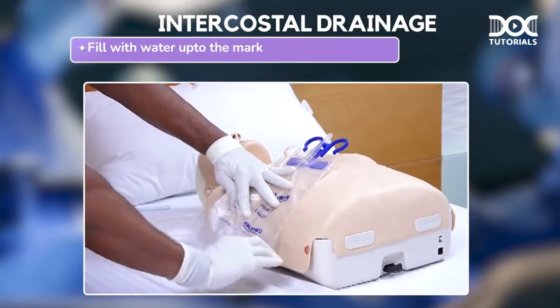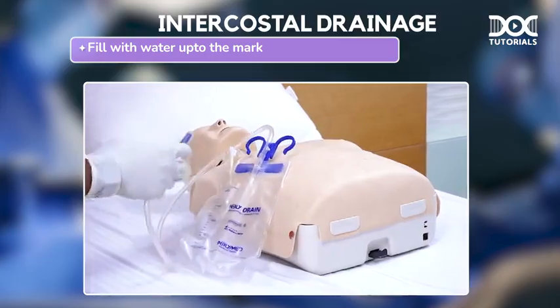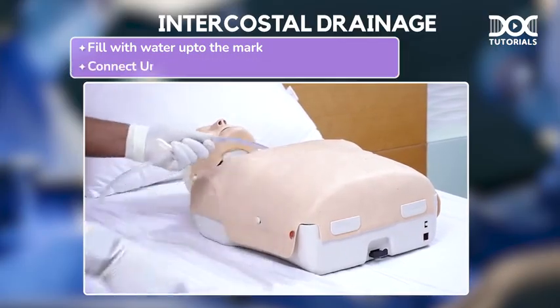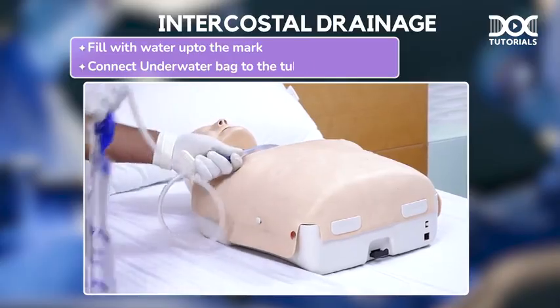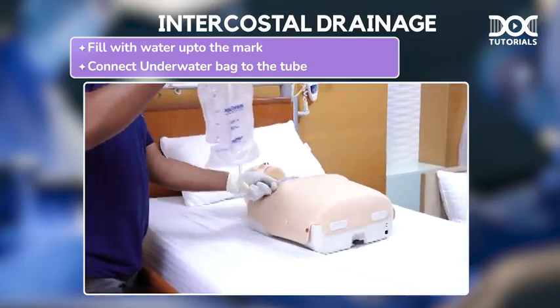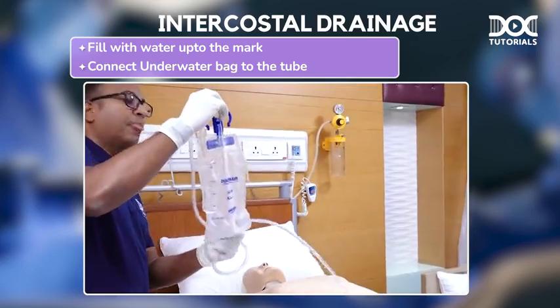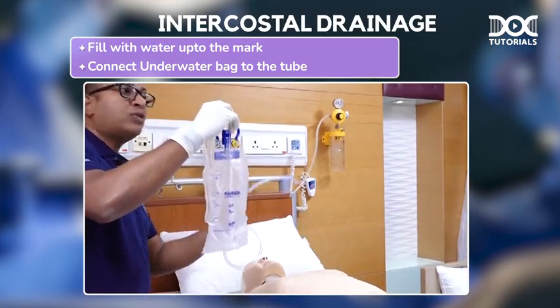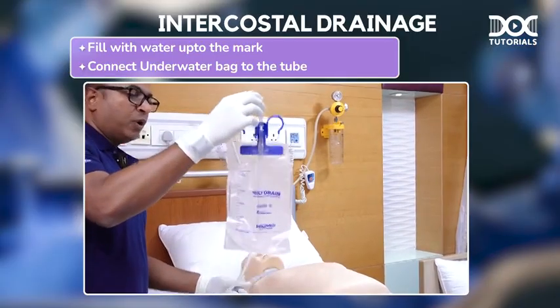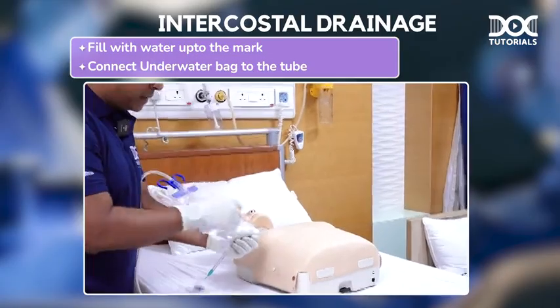This will be filled with the water up to this mark, and I will connect this tube with this. So this tube which is kept inside will be connected with this underwater bag, and it should be remaining at this level. So as you are putting this bag, please don't forget, we should fill the water up to this line so that the air from outside will not enter the tube. So very important point, don't forget, when I am putting a tube like this, air should not go from outside. That is prevented by this line.